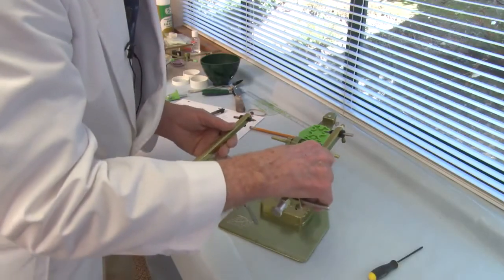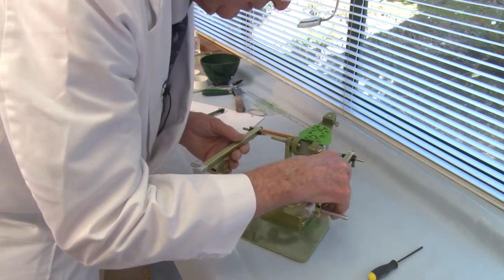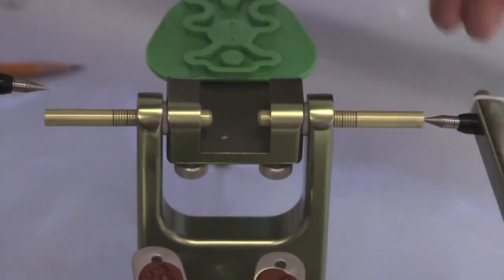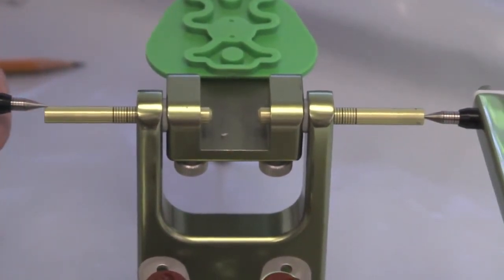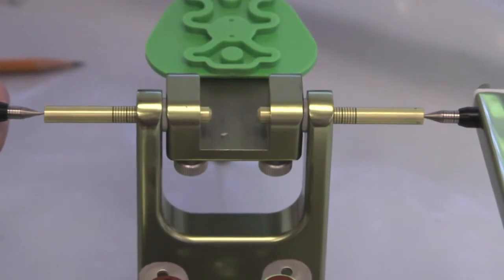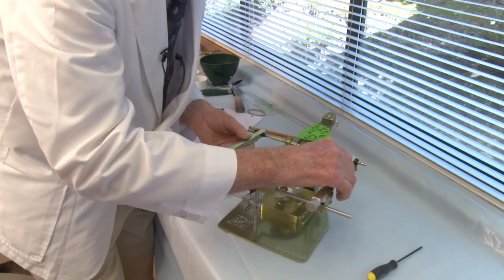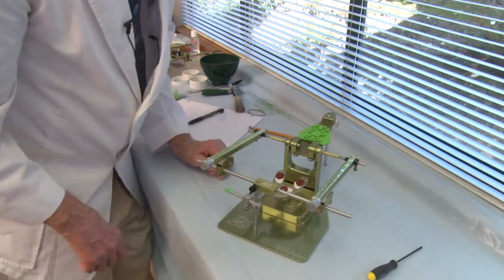Now then, I'm going to see how my measurements were. So I'm going to put the stylus pin in the hole on the left, and then look at the right side. It looks like it's about 1 millimeter over. Spring it out, put it in the hole. There's no play back and forth. Therefore, that's the measurement I need.